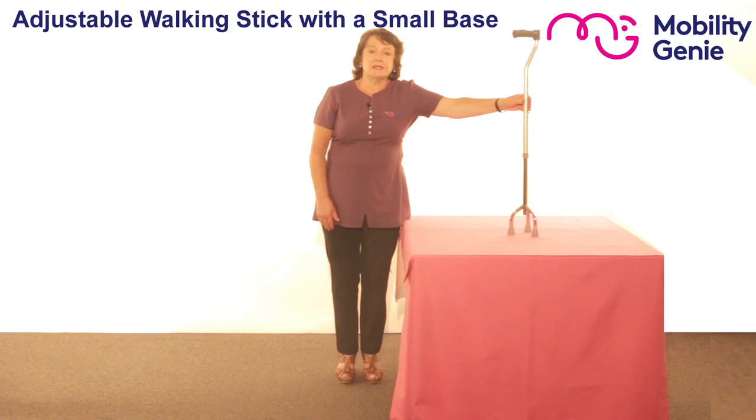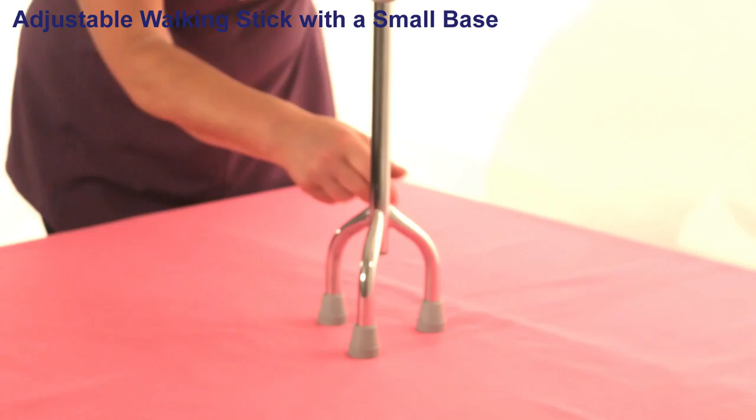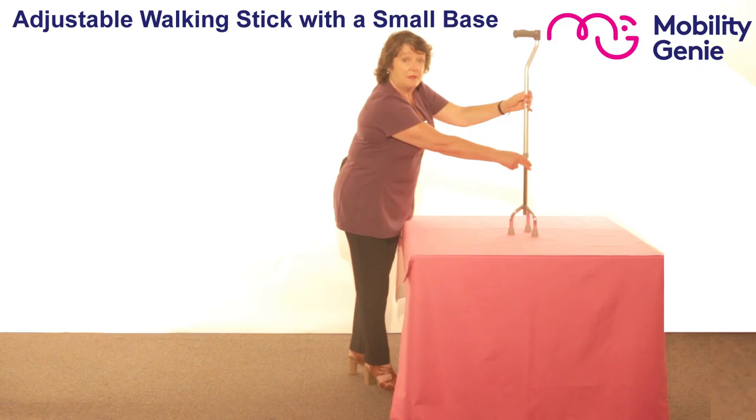Deirdre from Mobility Genie. At Mobility Genie we recommend this adjustable tripod walking stick with a small base. It features a chrome plated steel base that has three legs coming out of it, that's why it's called a tripod. The upper part leading up to the neck is made from lightweight aluminium and that leads up to a comfort grip handle.